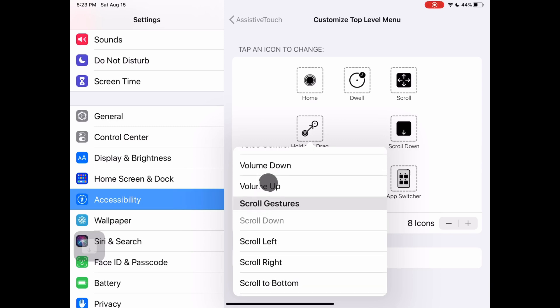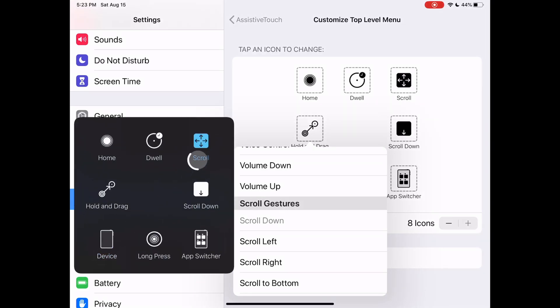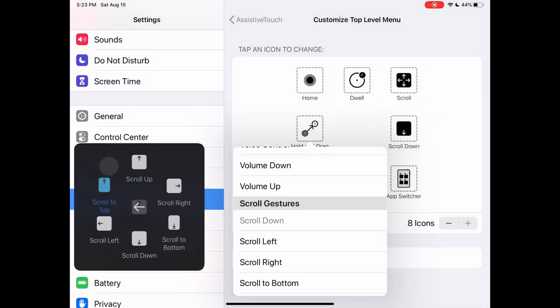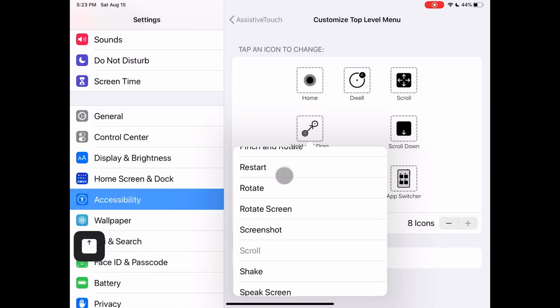Some are simple commands like home or app switcher. Others change your cursor actions like scroll down or long press. Others open up like a folder with more options like device, dwell or scroll.